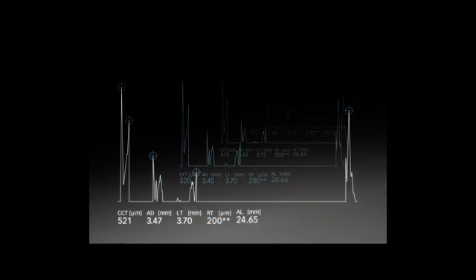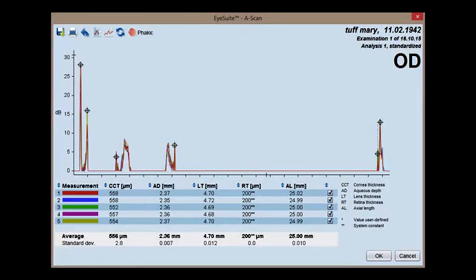These important data points are needed for advanced IOL power calculation formulas such as Holladay IOL Consultant, Olsen, and Barrett formulas, and it's especially important for the IOL calculation for hyperopic eyes. The single acquisition process saves valuable time by streamlining your examination process.